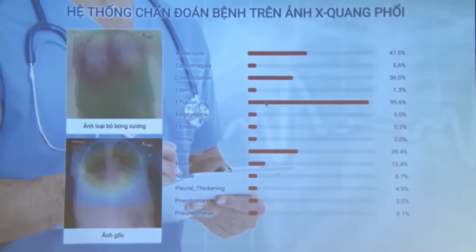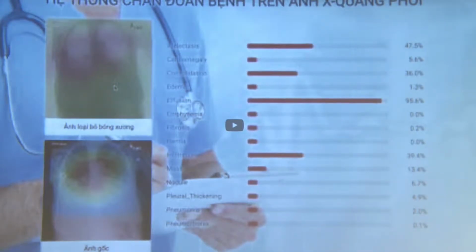Okay, you can see with an input as a chest ray image, our model can provide some useful extra information to the doctor to give a better diagnosis result. But the question here is why we need to build that model and why we choose lung disease. Following the survey from WHO in 2015, lung cancers share the largest proportion in cancer mortality, actually in USA.